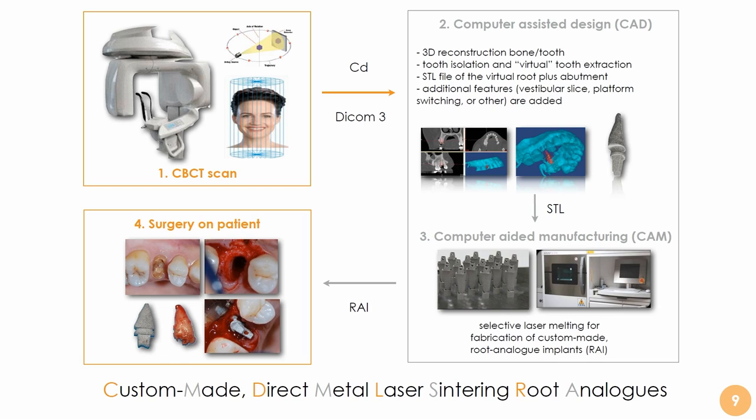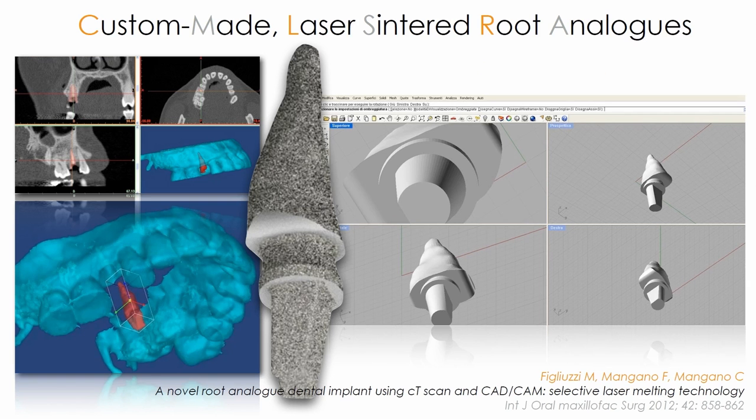And then we are ready for the clinical application. So this is the case. We used the EOS machine to fabricate these implants, and it worked quite well. We use a different percentage increment dimensionally of the same object, but at the end we use at all times the 0% implant, the 0% increment.